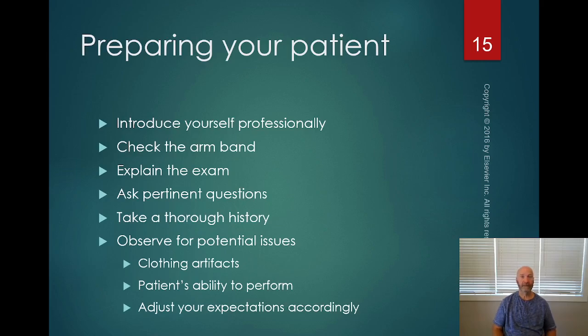That's my experience. They want to tighten it up and make it a custom fit, and they have a safety pin somewhere in it. They've forgotten that there's a safety pin in it, and they'll tell you there's no safety pin in it, but whenever you make your image and you show it to the patient, they say, oh yeah, I forgot all about that. So it's best to just go ahead and put them in a hospital gown rather than to run into any of that.